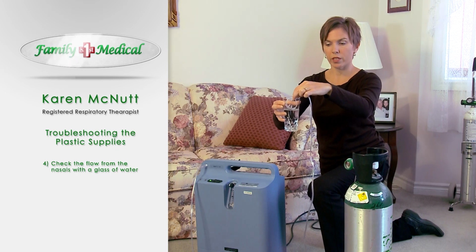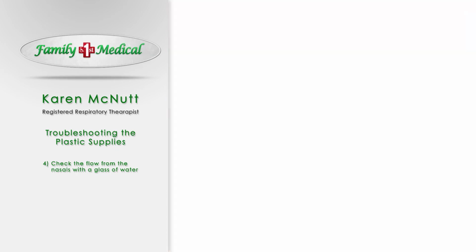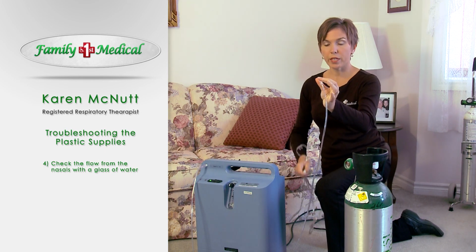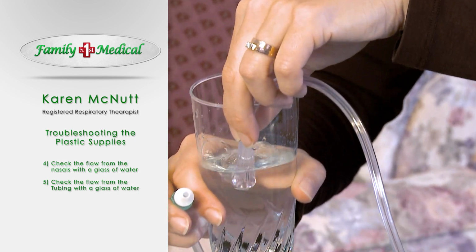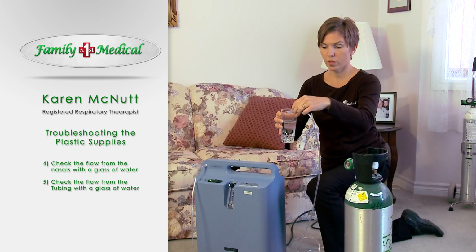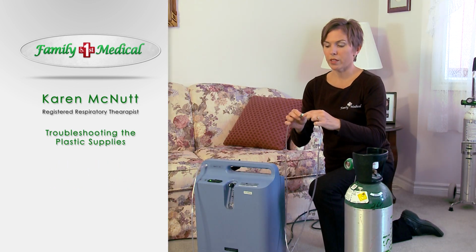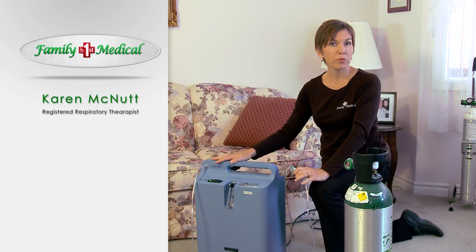If there's no bubbles in the glass of water, then we're going to trace our way back to the machine. When we come to the connection, we're going to pull it apart and place the tubing in the water. If there's bubbles from the tubing, but not from the nasals, then we know that's the problem. For our video today, we're simply going to pretend that the concentrator's not working right. In this case, there'd be an audible alarm.